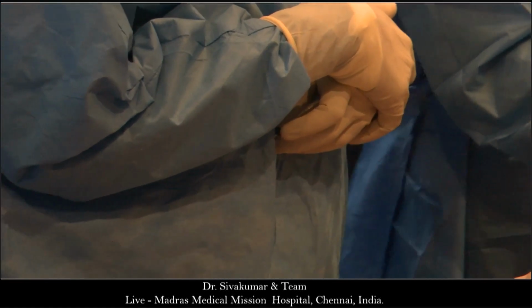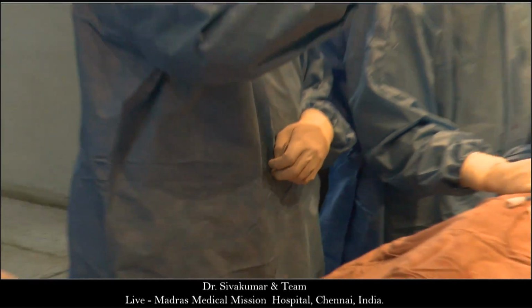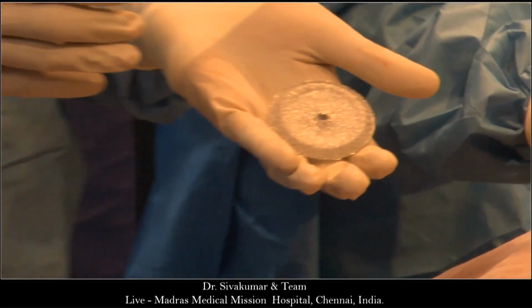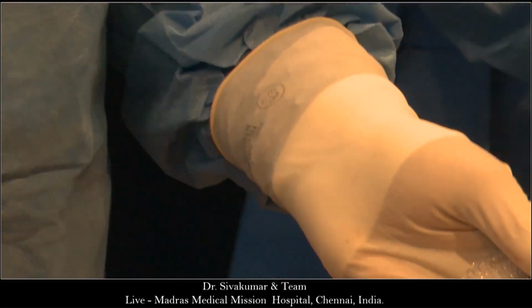Show the superior vena cava. Shiva, we're seeing your hands now. You're not doing anything naughty with your hands, Shiva. He's hiding a device, God knows what it was. He's hiding a device. He's decided on a device size.